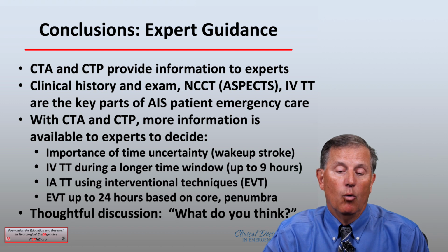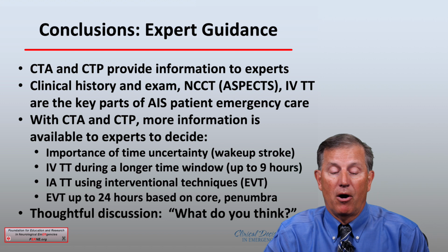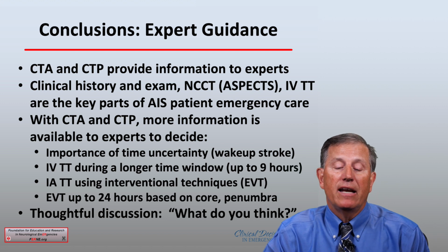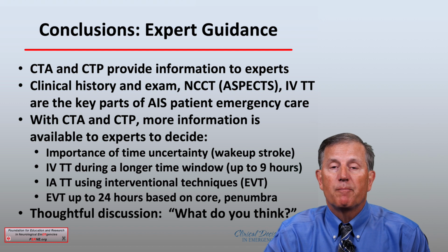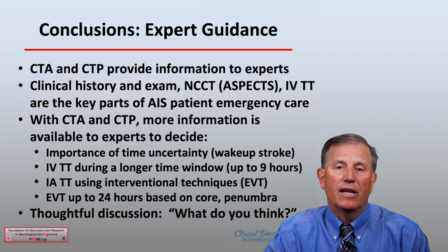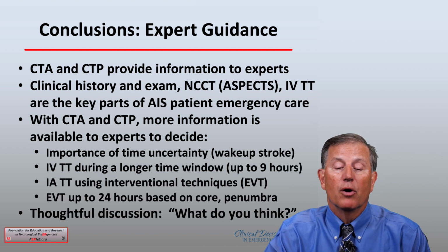In essence, CTA and CTP or their MR partner provide a thoughtful discussion about whether this patient should go to EVT and might they have benefit from this 6 to 24 hour EVT approach.